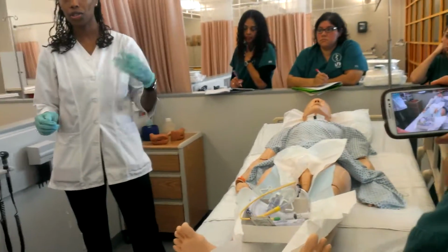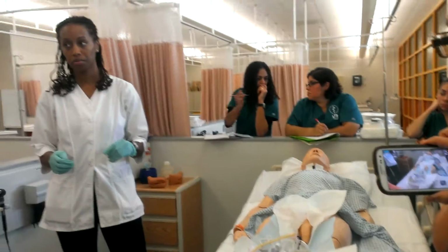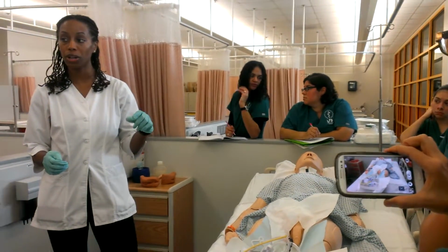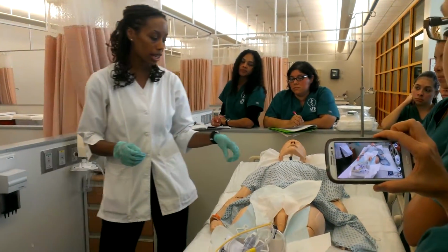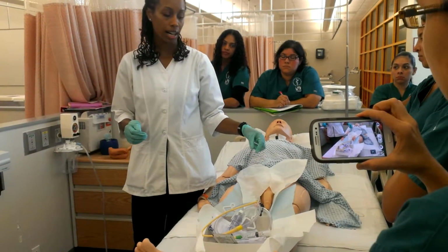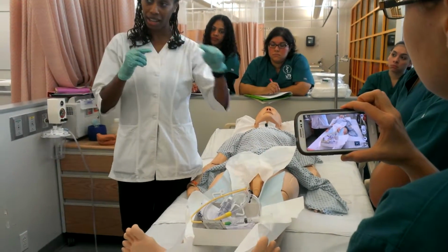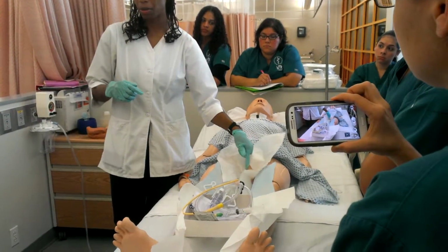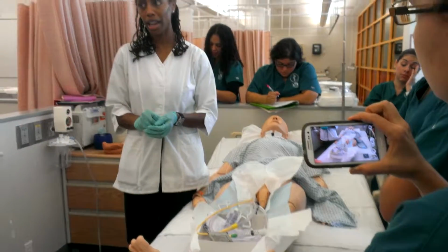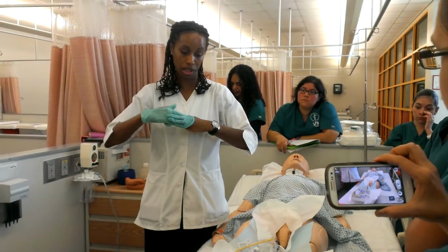How does the condom catheter work? The condom catheter goes on like a condom. And that's it. It's nothing invasive, so the risk for infection is lessened. The only thing is that with the condom catheter, you have to change it every 24 hours. And it's all in the technique and how you wrap that adhesive around it. Like the tape around it, you can't be too tight, can't be too loose, stuff like that. But it has to be changed every day. But it's not invasive, there's no risk for infection.